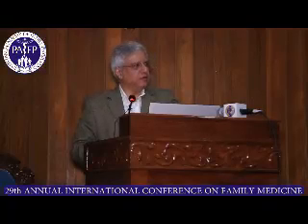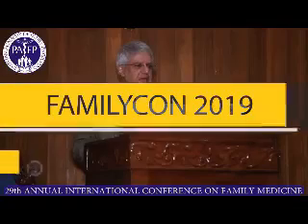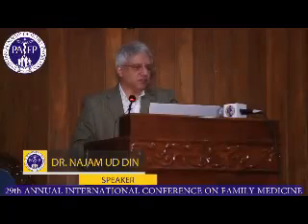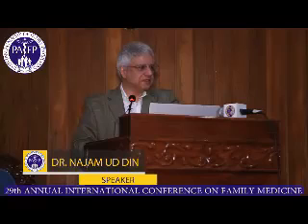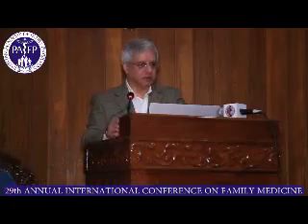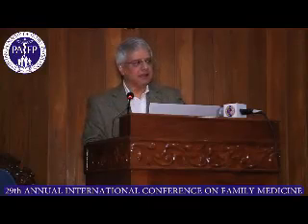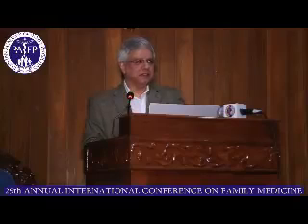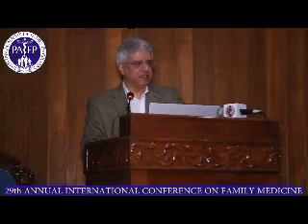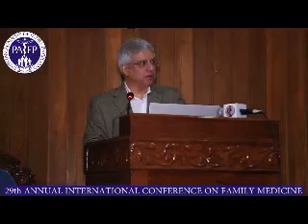I'm sure all of you know that there is no match to assessment of an intracranial lesion, the majority of intracranial lesions, when it comes to use of MRI. It cannot be compared with CT nowadays because of the battery of tests which are available in MRI, unlike the CT scan. But CT scan still has not gone out of fashion. It has made a resurgence, it's come back, and I'll share the actual justifications from a couple of tables for use of MR and CT and why one against other.